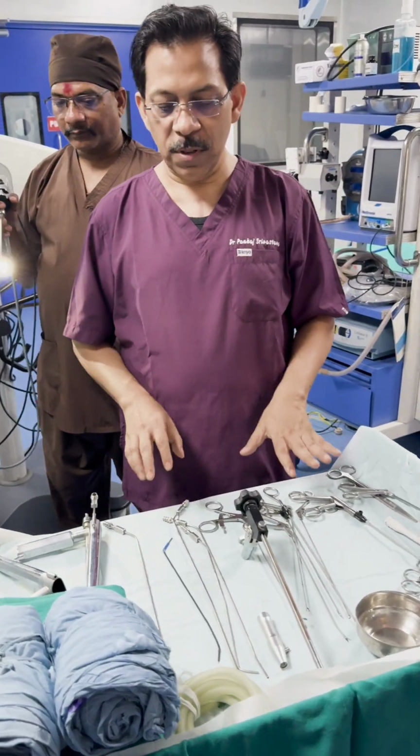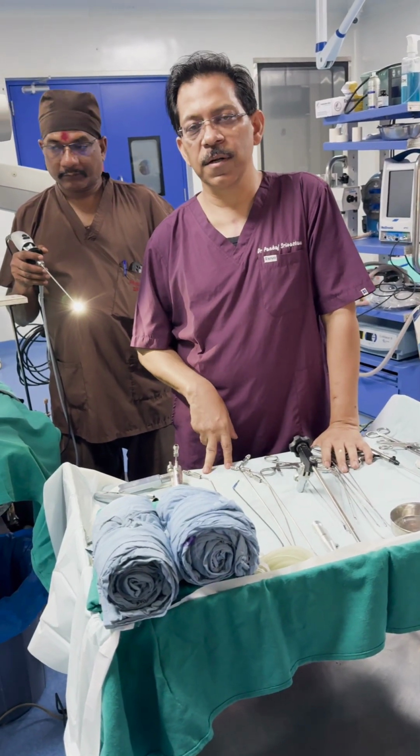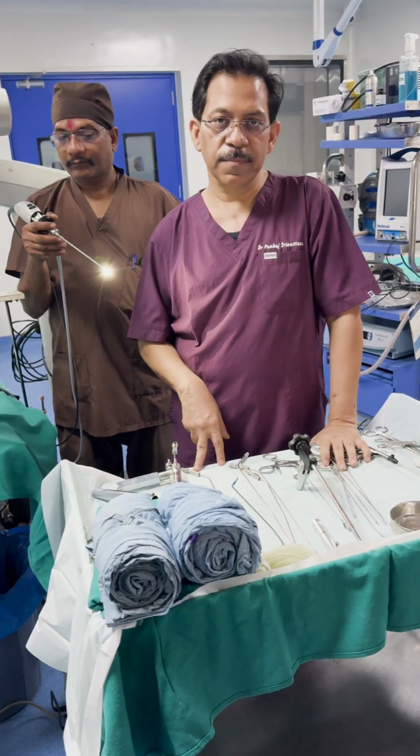Even after doing all these things, there are a few patients where we have to abandon the procedure because the lesion is either not visible or we are not able to remove it.